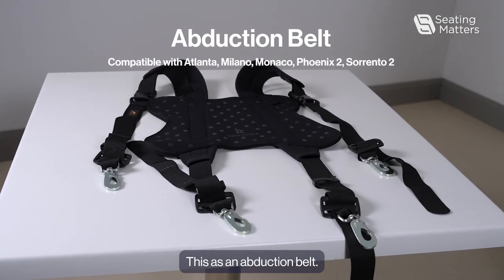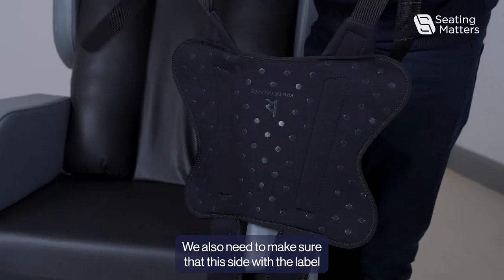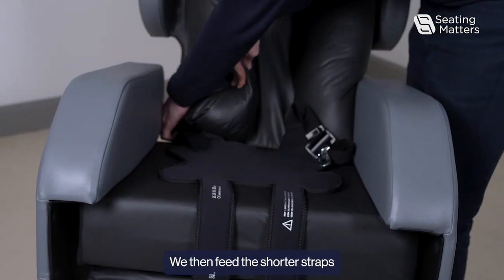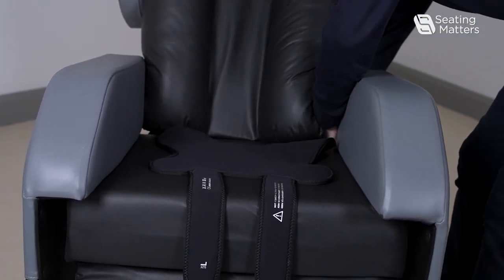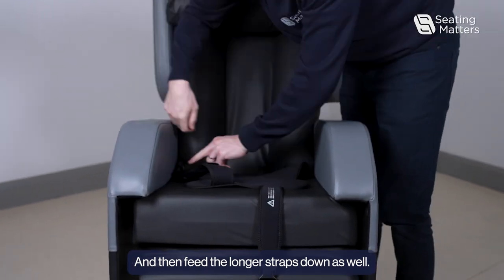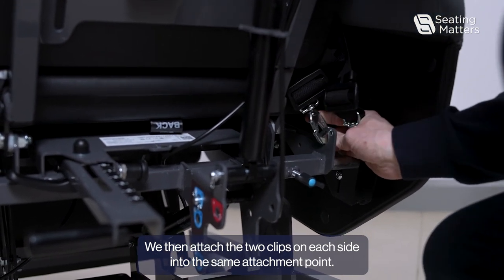This is an abduction belt. When fitting the abduction positioning belt, we need to make sure that the long straps are located towards the front of the chair and the shorter straps are at the back of the chair. We also need to make sure that the side with the label is actually on the seat. We then feed the shorter straps down towards the back of the chair.